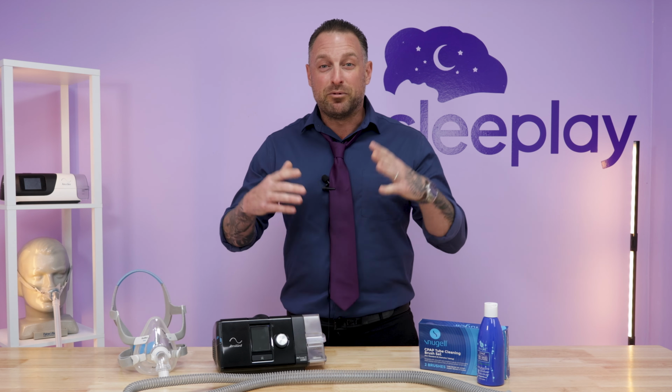Let's first talk about the supplies. You need a place to clean these products, so they recommend a tub, sink, or a container. You want to make sure you rinse these things out to prevent any extra bacteria from getting into the accessories for your CPAP that you're going to be cleaning. The second thing is the water. You're going to want distilled, filtered water, preferably 86 degrees. Ladies, get your cooking thermometers out.